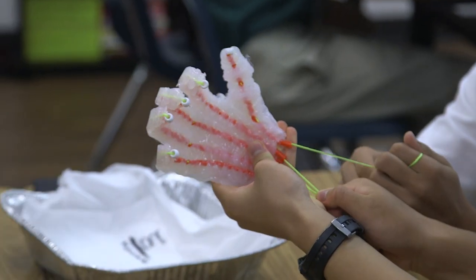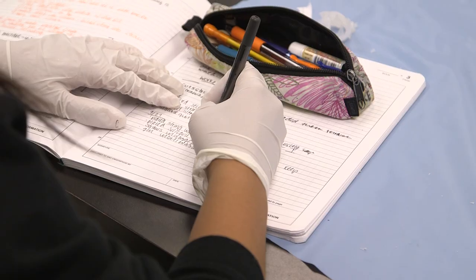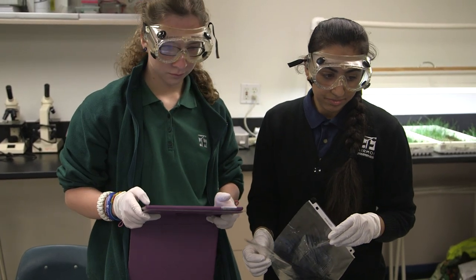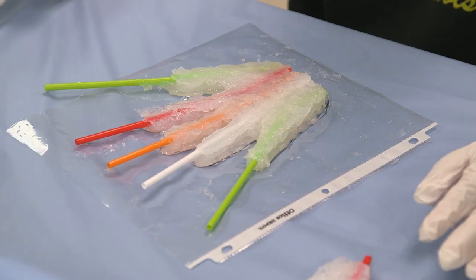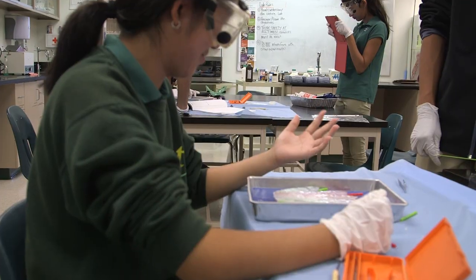Throughout this week and last week we've been building model hands out of silicone, straw, and string. We were not given a procedure or any background on how to do it — we had to do our own research and figure it out ourselves. The point was to create a prototype and model, and using that, understand the engineering process: problem, solution, problem, solution.